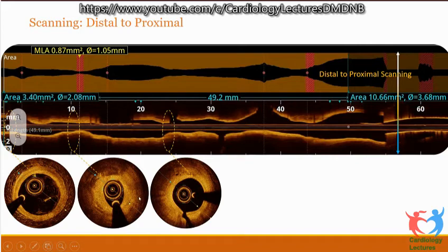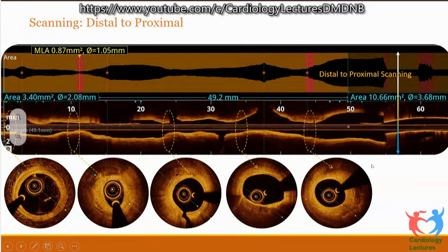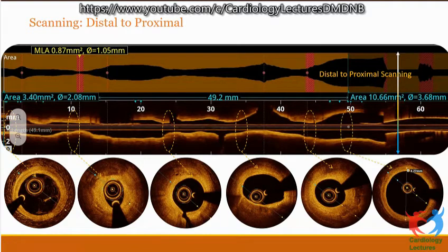You can see a thick fibrous plaque buildup along with a calcific nodule at 12 o'clock position. And in this view, apart from the guide wire, there appears to be a small tear. There is a calcific plaque extending from 6 o'clock to 9 o'clock position, along with some amount of fibrosis and some calcific deposits, deep calcium in the proximal part of the vessel. And near the ostium, we mark the proximal segment, which appears to be pretty good for landing the stent.